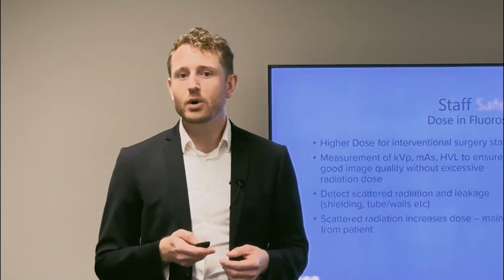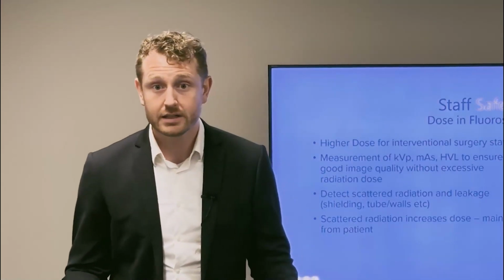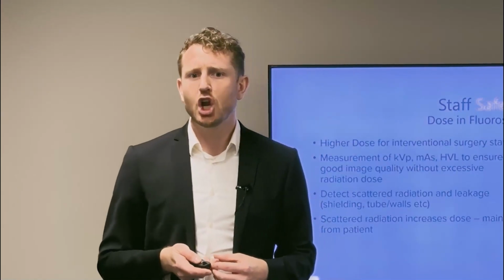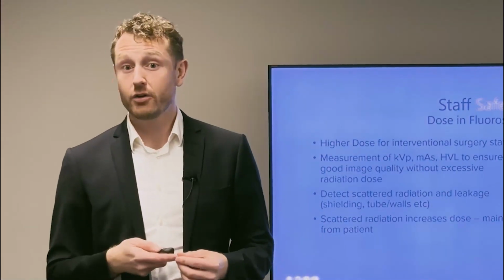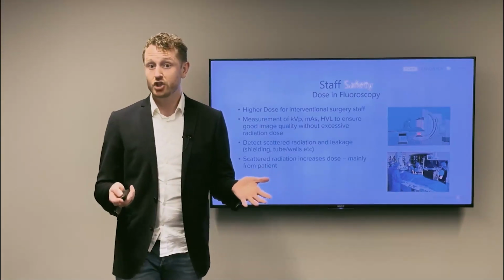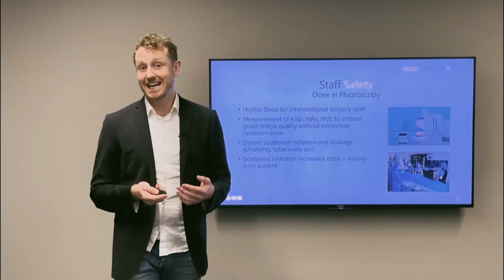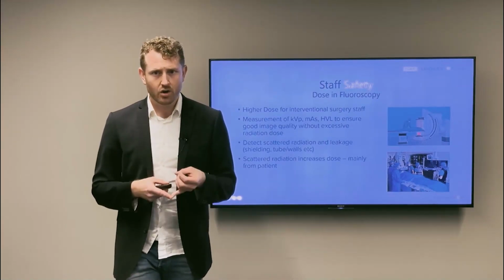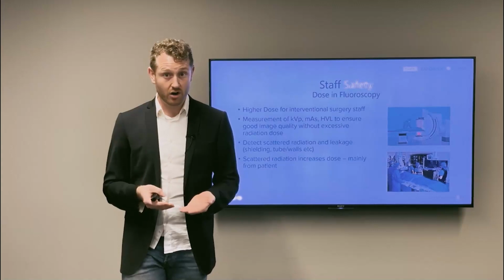Since the exposure time is seconds at a time, and maybe 30 minutes of total exposure time during the surgery, the energy of the photons must be much lower compared to regular radiography. Otherwise, the patient and the staff in the surgical room will get an insane amount of dose. Even though the energy is low, the procedure time is long.